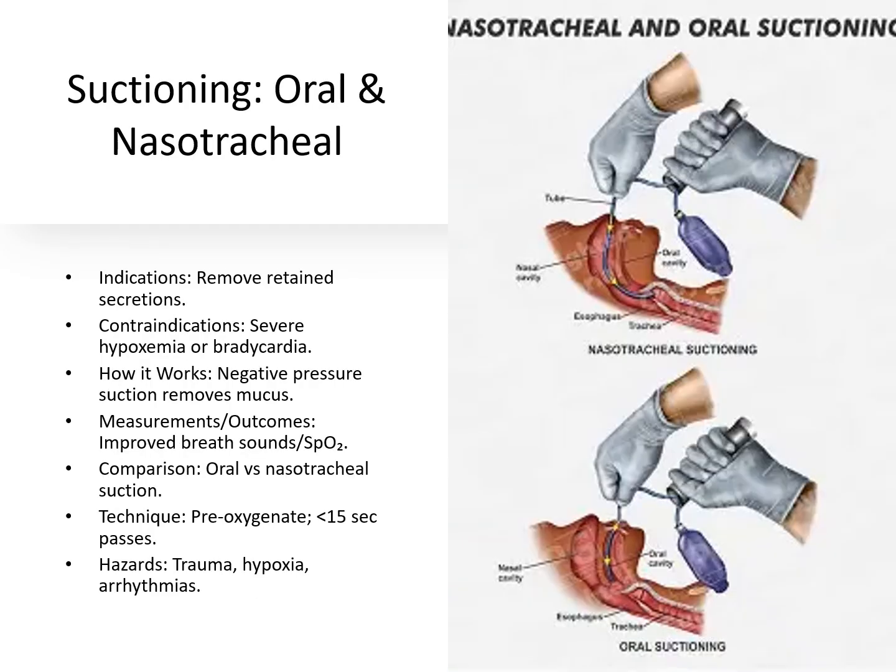Suctioning removes retained secretions when patients can't clear them. Contraindications include severe hypoxemia or bradycardia. It works by applying negative pressure to remove mucus. Outcomes include improved breath sounds and oxygenation.